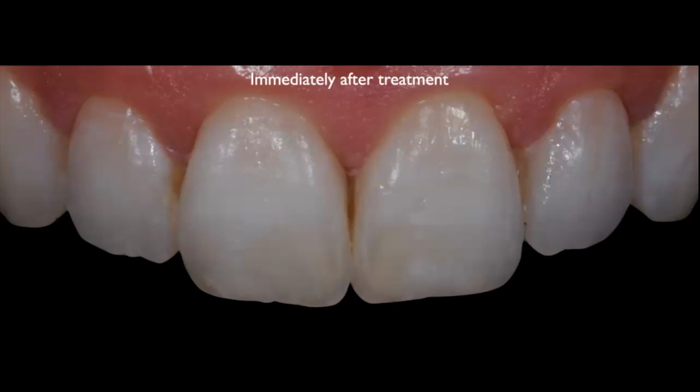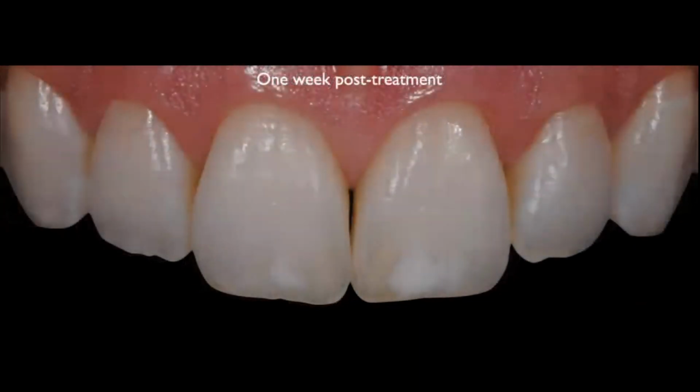And again, initially, you're going to get this translucent enamel. You can see how translucent the enamel is on the middle and incisal third. You don't see any of the white spots left after this first application. And again, this is immediately after. Now, 1 week later, once the teeth rehydrate, you can see that we got some of the white spots back. This tells you how deep these white spots were in this area of the tooth. And at this point, we ask the patient, is this something that still bothers her? Yes or no. In this particular case, the patient was really happy with the outcome. She was not worried about having these smaller white spots.